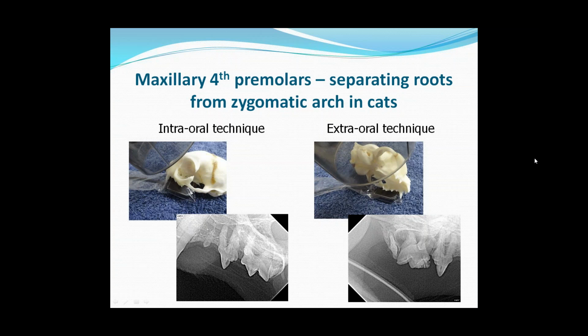In a small cat, you may be able to get the 6 maxillary incisors plus the 2 canines on one film, but in a larger cat, if you're using size 2 films, you may need to take 2. So between 6 and 7 films generally, and I find our nurses can normally do a full mouth series in about 2 minutes using a DR system.